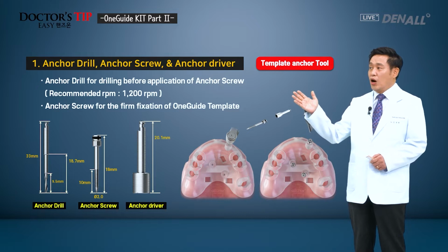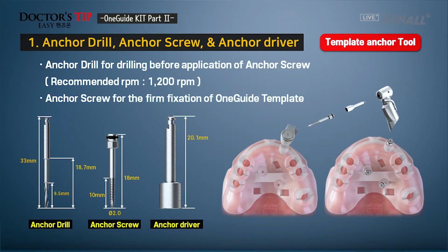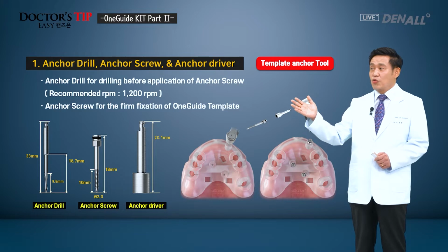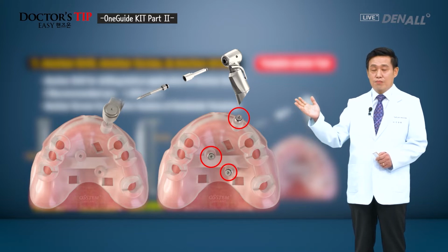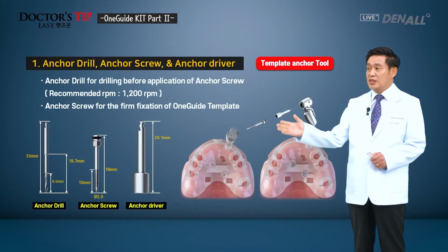As I mentioned before, OneGuide template needs to be fixated more firmly. In the case there are teeth, the OneGuide template does not really move, but in the case of edentulous cases, because of mucosa's resilience, the template can be deviated, the position can be deviated. In those cases, using 3 anchor screws on palatal and buccal, you'll be able to accurately fixate the template. It can be done firmly. Anchor screw is used for this.